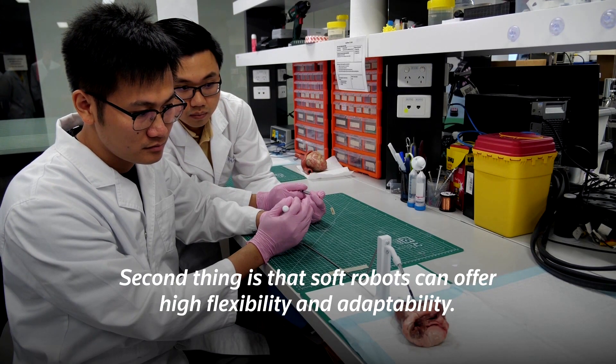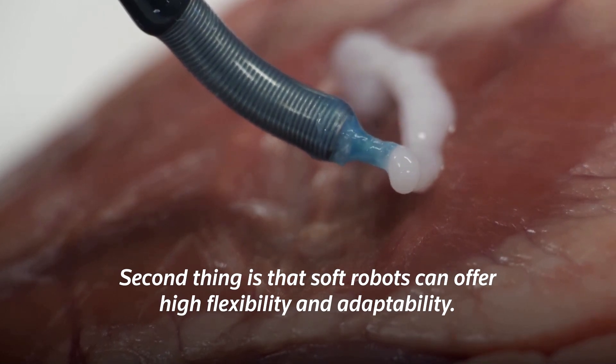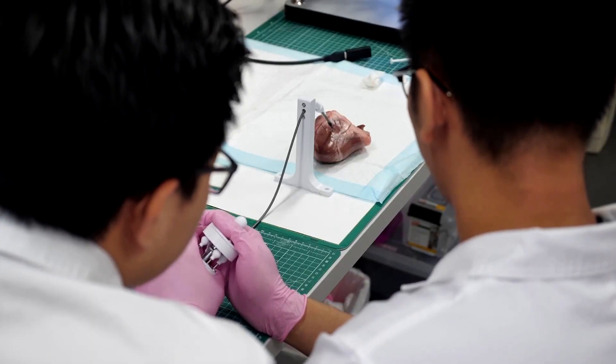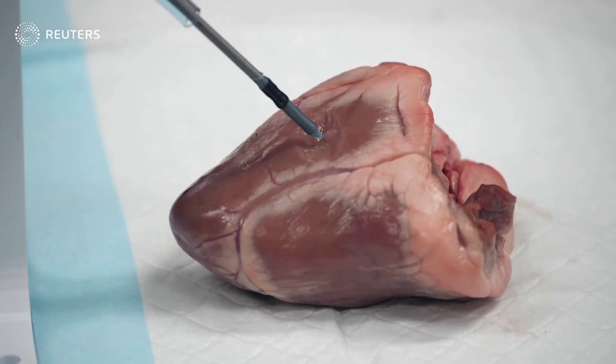Soft robots can offer high flexibility and adaptability, meaning they can reach any area inside the human body. Pending further clinical trials, Do believes the device is on track for commercialization in the next five to seven years.